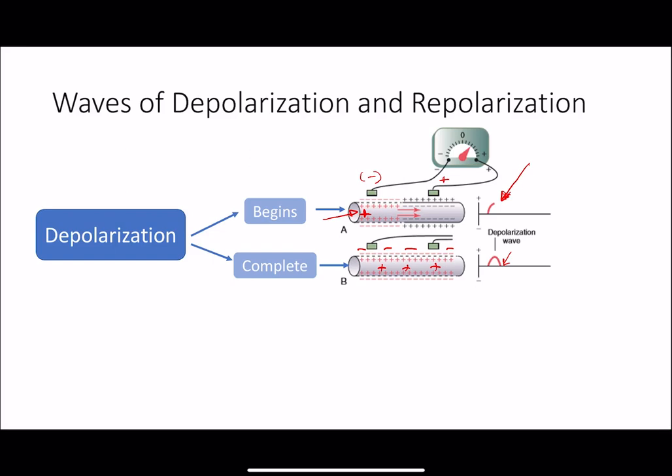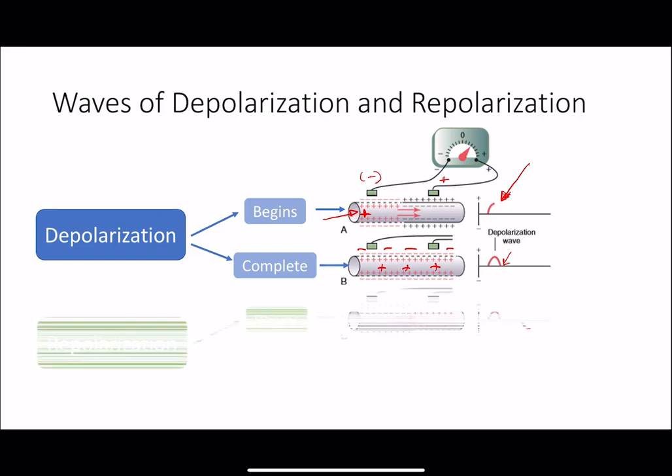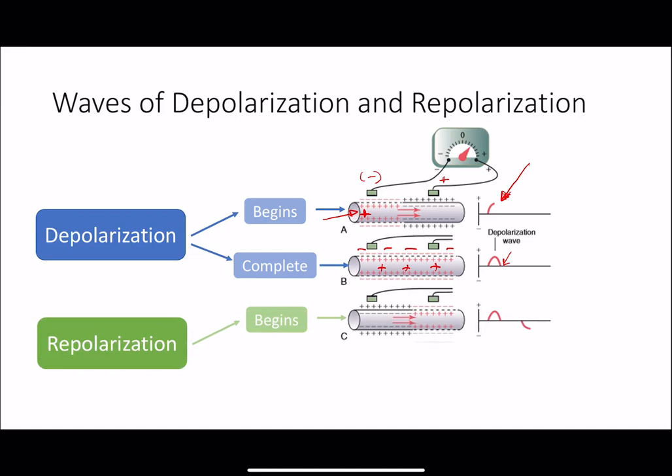Okay? When a heart is completely depolarized, it must repolarize. So repolarization is a return to your baseline resting potential where we are negative inside and we will again become positive outside. So in this situation, your reference electrode and your positive electrode are still in the same place. So your exploring electrode is negative when compared to your reference electrode.